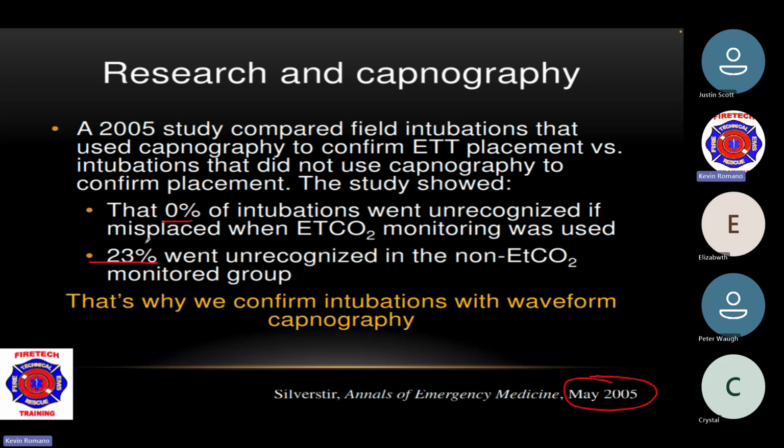All right. This is why it's so important that we have this to recognize, hey, this is not the right hole. We need to make sure we re-intubate these patients. We also want to make sure that we're not over-ventilating our patients, causing that significant gastric distension. And if there's any paramedics in the room, whether the patient's in cardiac arrest or you RSI them and intubate them, if you're ventilating a patient, put an OG tube in and relieve that gastric distension.